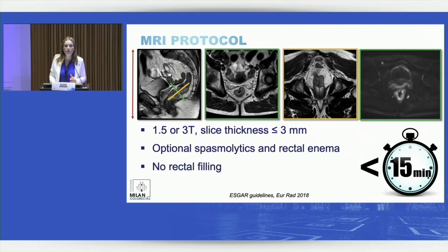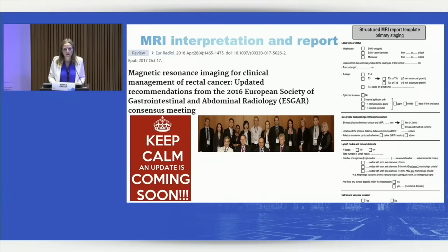We need to have high resolution, so the slice thickness needs to be a maximum of 3 millimeters. And you can administer the patient some spasmolytics or rectal enema to reduce the artifacts. We do not advise to do rectal filling.